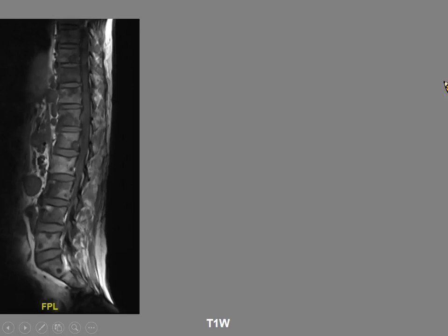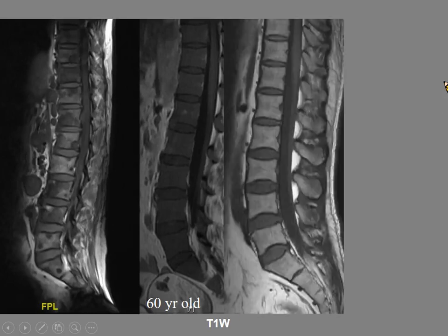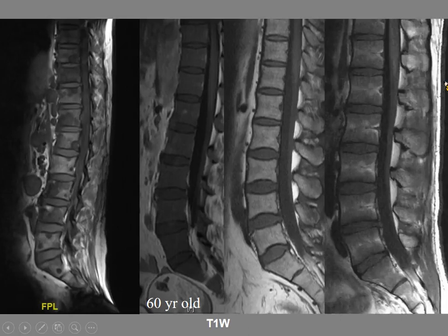What is sometimes more difficult to assess is when there is diffuse infiltration, as in this patient. And the key to making the diagnosis is to remember that in a 60-year-old patient, the marrow should have a higher signal, somewhat like this, rather than the low signal that you see here. This is more commonly seen in a younger patient, but even in a younger patient, you tend to see some fat around the central venous plexus, whereas in this case, even that is lost.